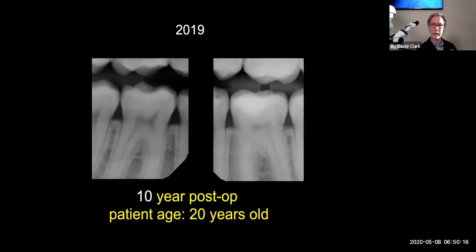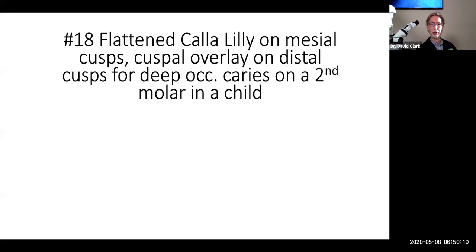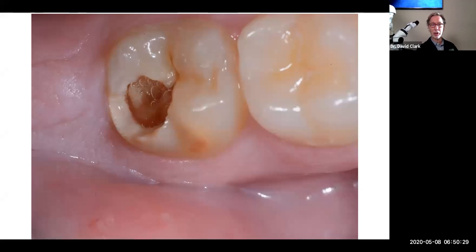So it's different thinking. All right, so I'm going to show a case from the syllabus of a very similar tooth that I treated very differently. I'm going to show you how different it looks today compared to what I did 10 years ago, all right? So this is a tooth from the syllabus, same thing. We know that if we do full caries removal on this case, there's a 100% chance you'll be in the pulp. There's a 100% chance on this tooth that with complete caries removal, you're going to run into the pulp.